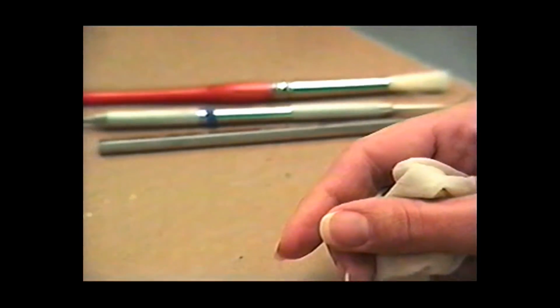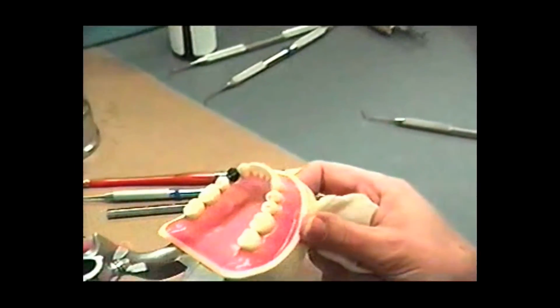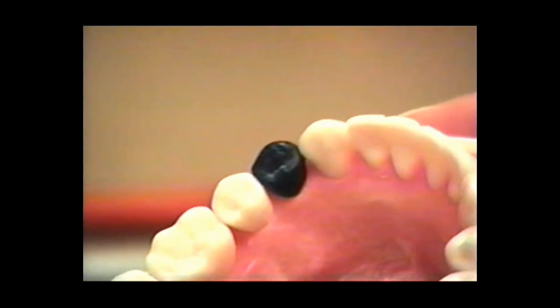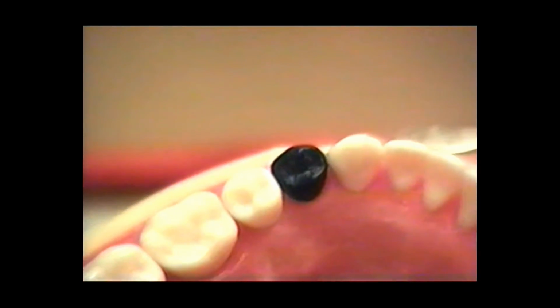A word about proximal contacts. Once you get your axial contours on your waxing, hold this up to the light and look through it. I can't do that and show it on the camera, but you look through it and make sure that you can't see through your proximal contacts. If you can see light through your contacts, you have an open contact, and right away that's the standard not met. I've seen a lot of waxings that have open contacts, and everything else about them looks great, so just don't forget to check that.